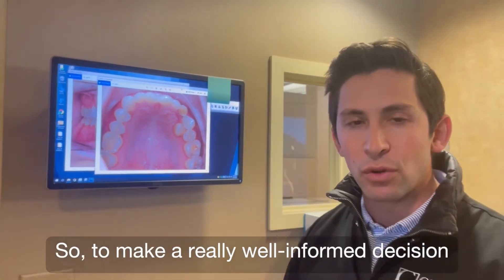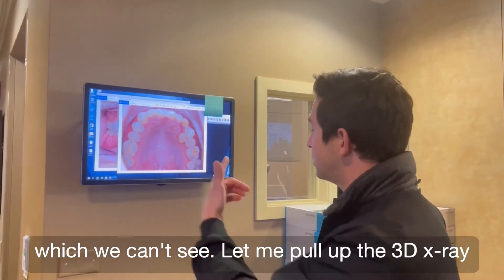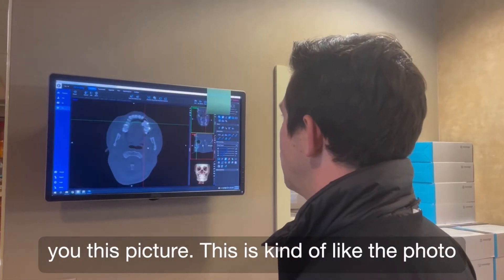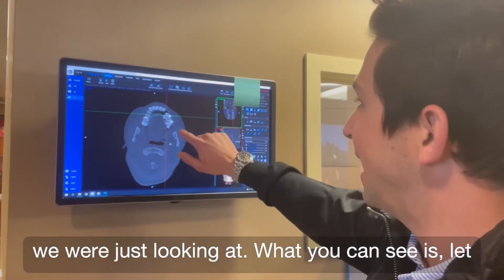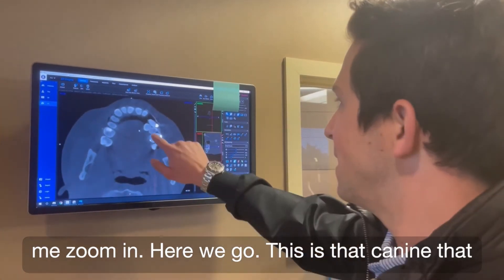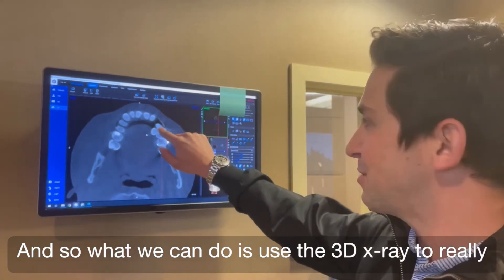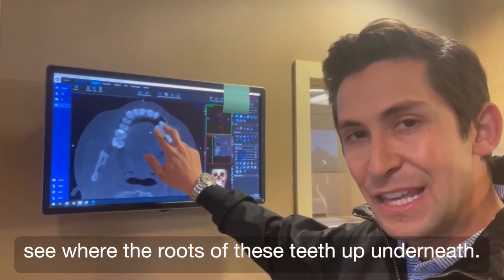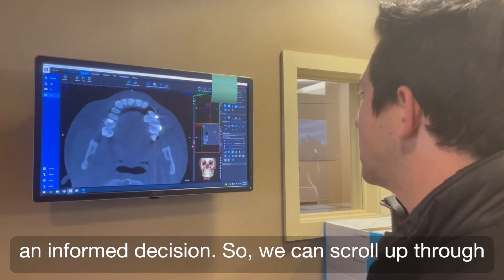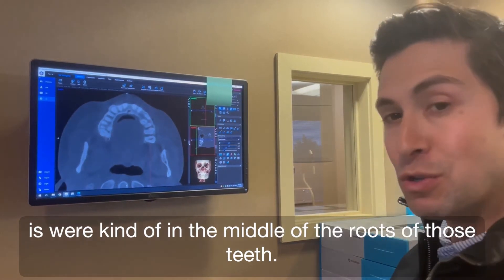To make a really well-informed decision about that, it's important to know the position of the roots of these teeth up underneath, which we can't see. So let me pull up the 3D x-ray that we took. This picture is kind of like the photo we were just looking at — here's that canine we were talking about and here's the premolar. We can use the 3D x-ray to really see where the roots are, and whether we should move them this way or that way to make an informed decision. Scrolling up through the patient's teeth, we're now in the middle of the roots of those teeth.